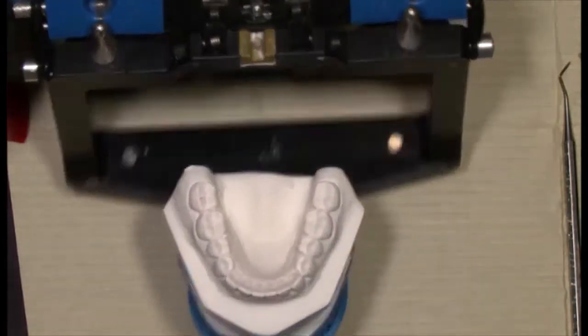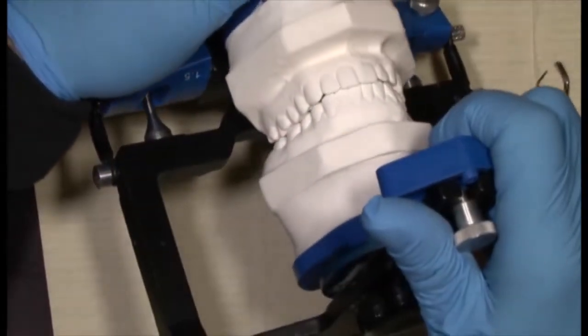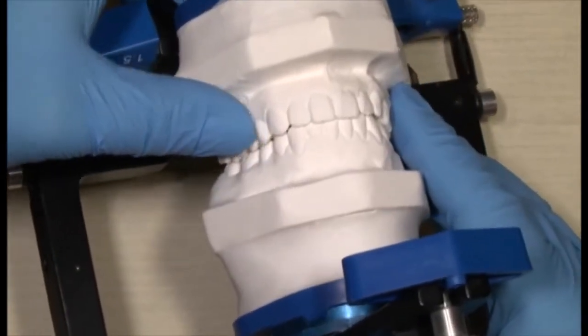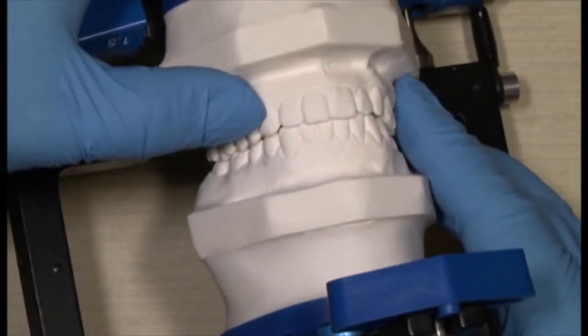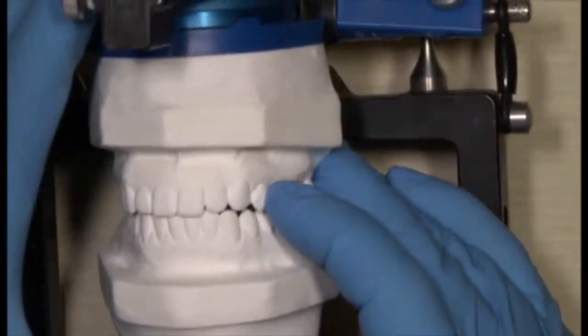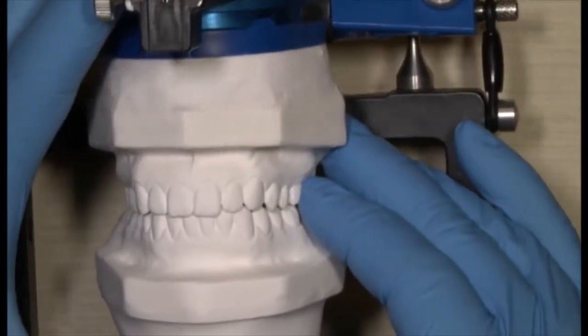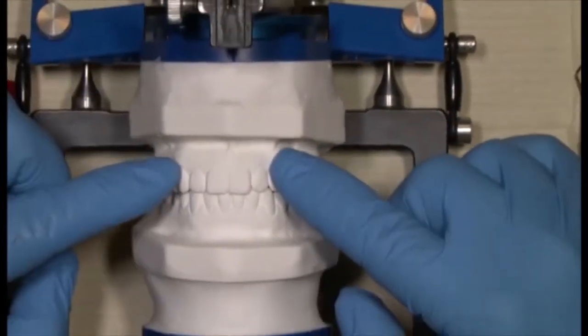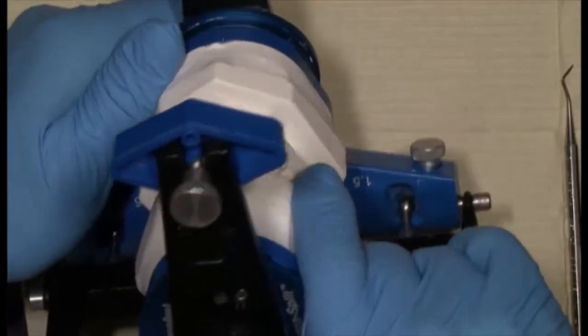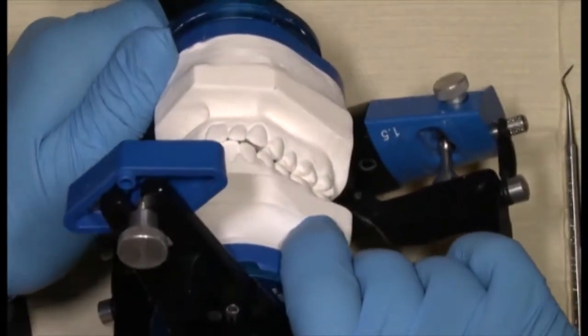Now, as we take a look at the models and the way they fit together, the goal is equal simultaneous contact from second molar to cuspid on each side, and also, remember, at equal intensity. Now this has to be achievable before the anterior teeth come into contact.